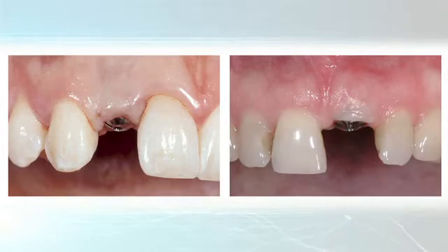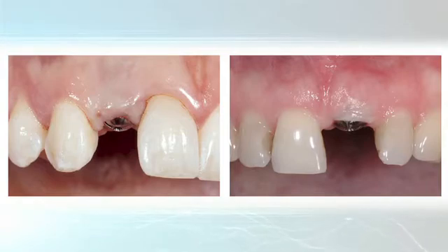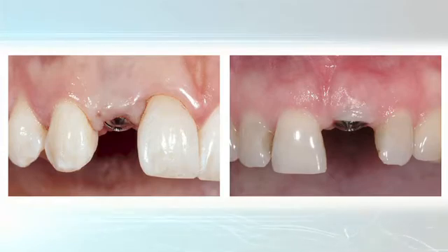The right lateral incisor was an example of a congenitally missing tooth where the orthodontist opened the space up, surgeon placed the implant, let it integrate for a period of 4 to 5 months, and then placed the healing abutment and uncovery, and now it's time for the restorative dentist to correct the gingival contours.